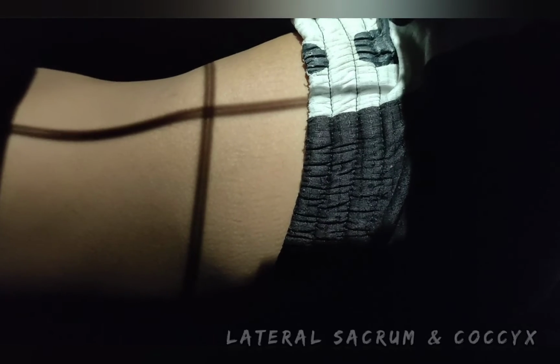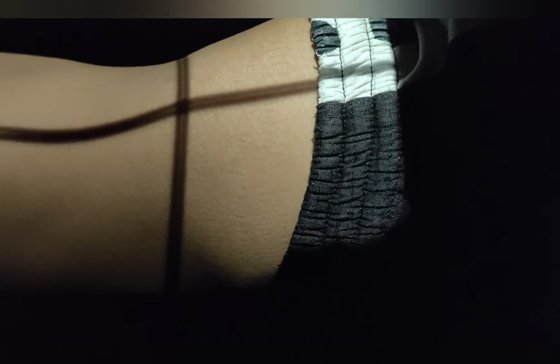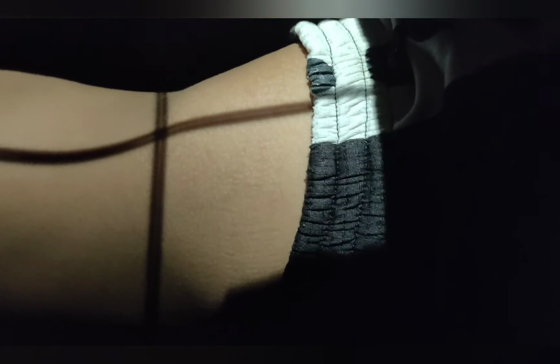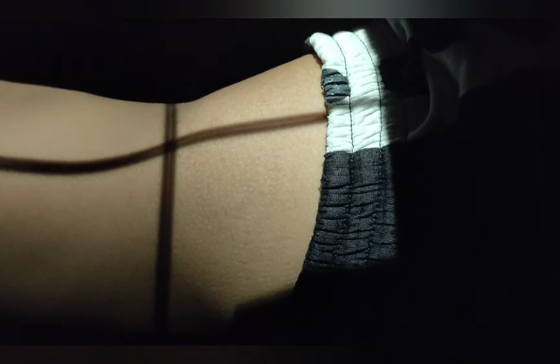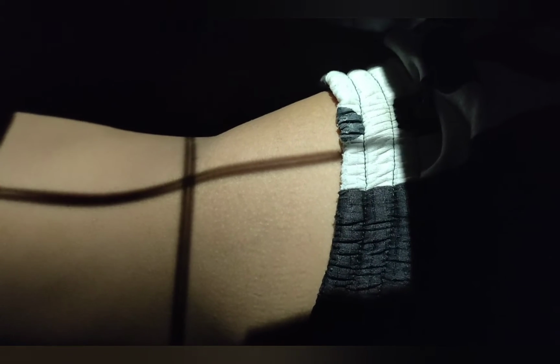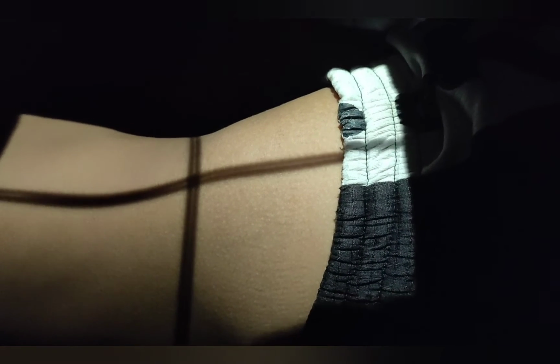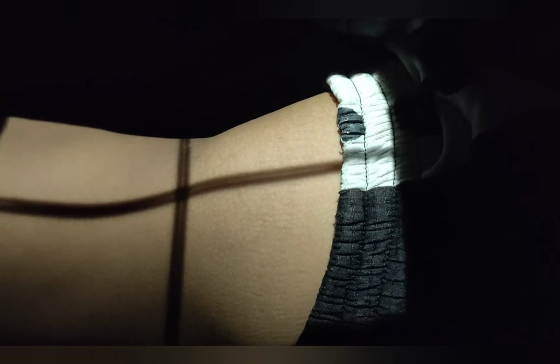Lateral sacrum and coccyx position. So patient position is lateral position. Part position, align long axis of sacrum and coccyx to CR and midline of the table. Then ensure that no rotation of thorax or pelvis. Then CR is perpendicular to IR, direct CR 3 to 4 inches posterior to ASIS. Respiration is suspend.